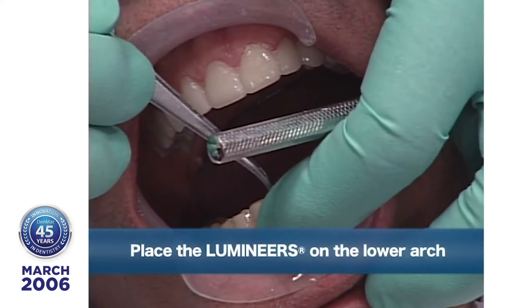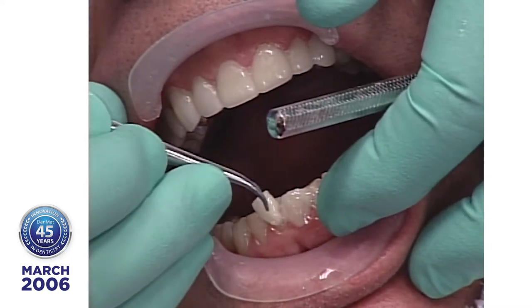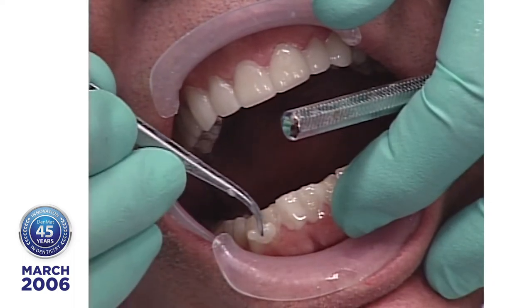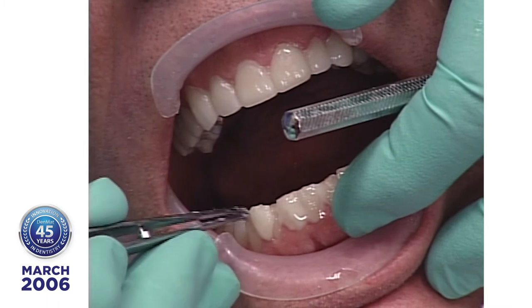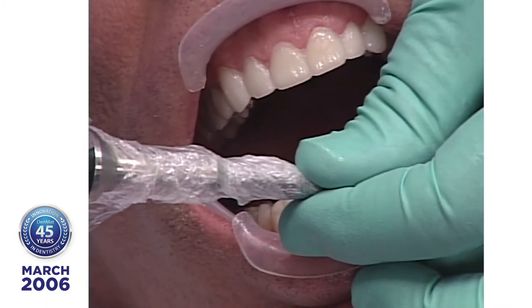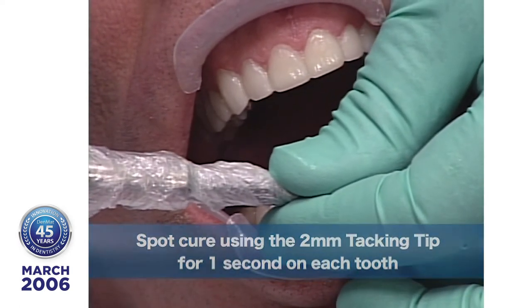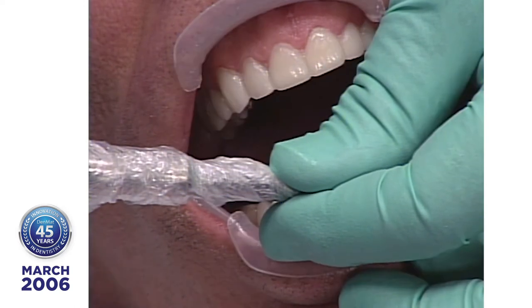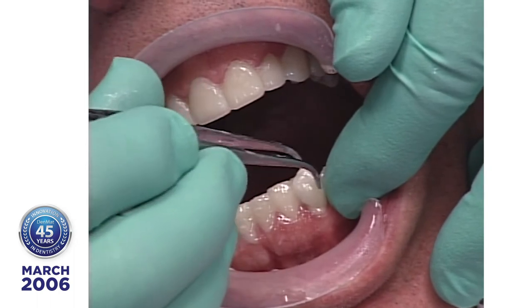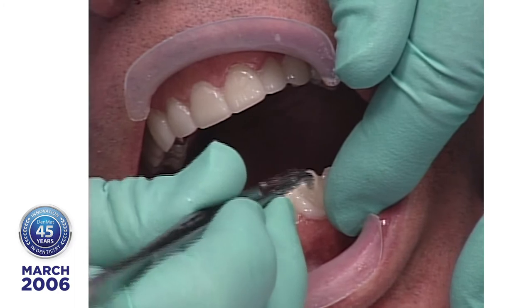Okay. Right central? Okay. Right lateral? Here. Now give me the 2 millimeter tip for 1 second. Close your eyes. Okay, now we'll go to the left side and put the cuspid and the bicuspid. And you notice I did not cure the most distal veneer.